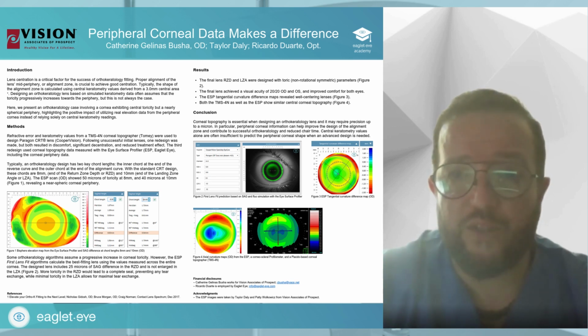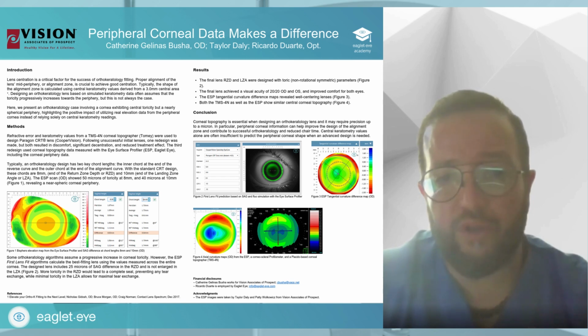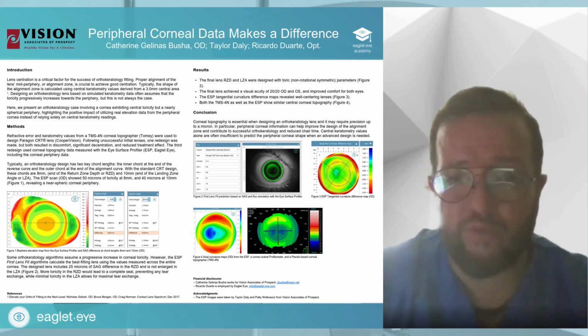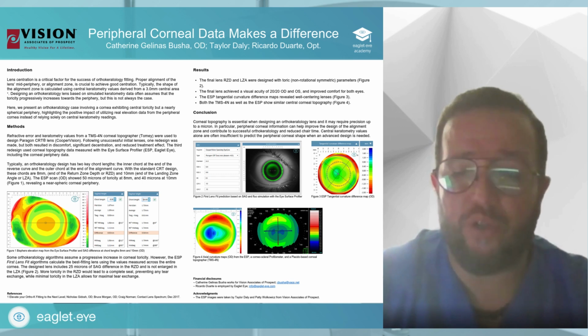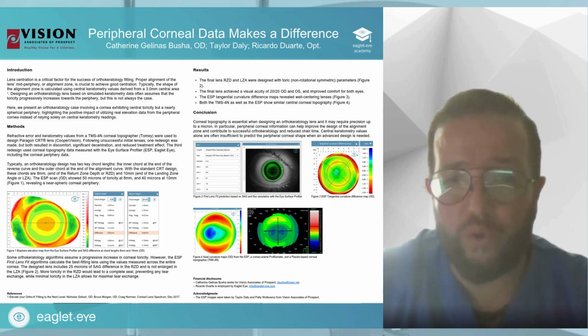And it is so magical that 25 microns can make that much difference on centration for that patient and comfort. So with these 25 microns, they actually gain good centration, a non-rotational lens, and they actually gain a 20/20 visual acuity. So this is why it is so critical to measure the whole cornea, limbus to limbus, and with the ESP, we got that ability to do so.